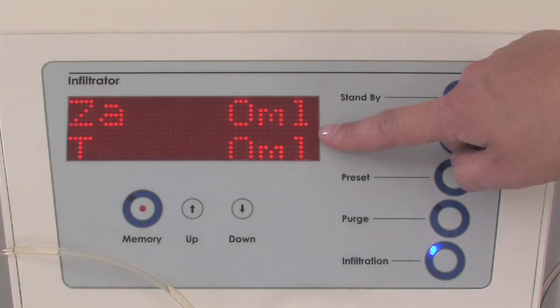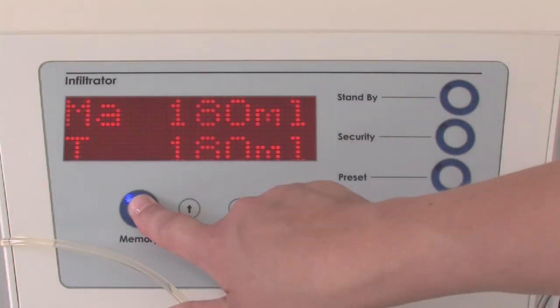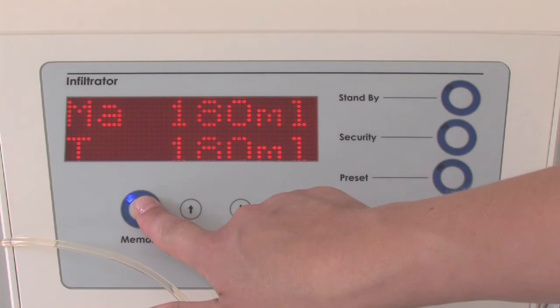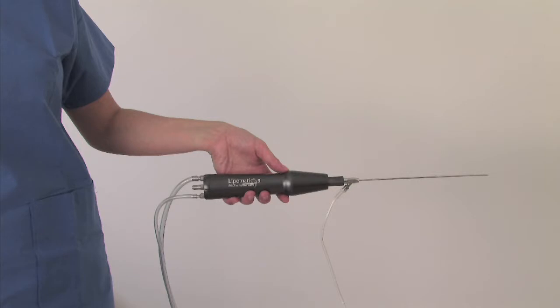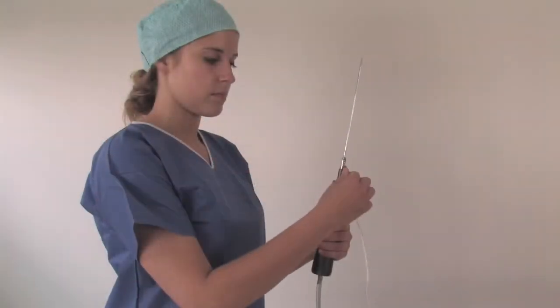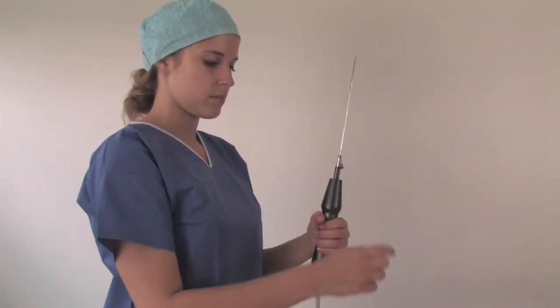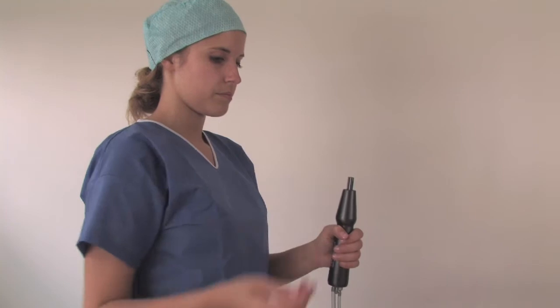The control panel displays the quantity of infiltrated liquid by body zone, but also the total quantity of infiltrated liquid. Via the memory button and the up and down buttons, the user can move around the zones to see the quantity of liquid infiltrated in each zone and to see the total quantity infiltrated. It's highly recommended to hold the Lipomatic lightly to avoid feeling the vibrations. When the infiltration process is over, remove the perfusion line from the Lipomatic and unscrew the infiltration cannula.